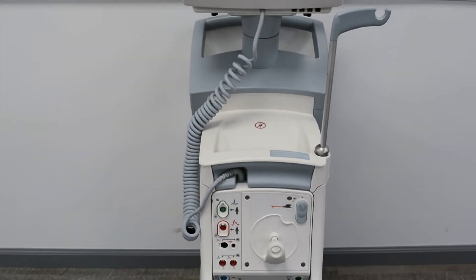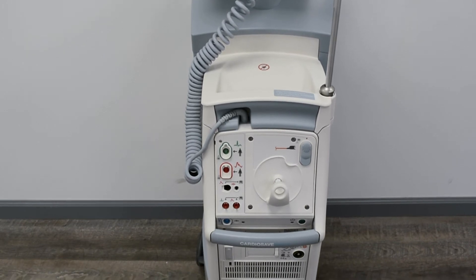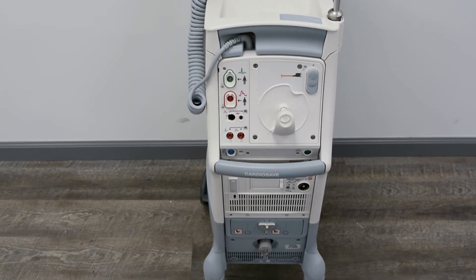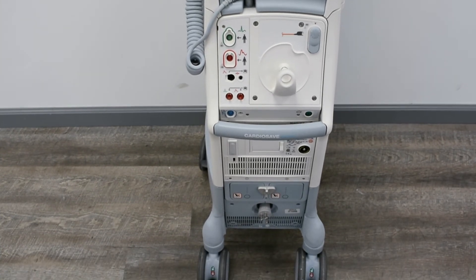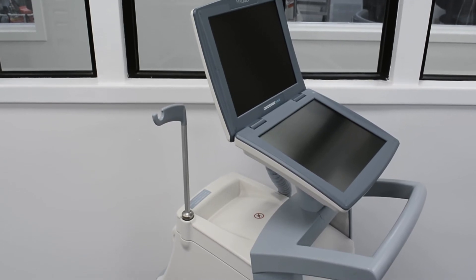The CardioSafe Hybrid is designed for use with all McKay IABs. Soma Tech International offers the refurbished McKay CardioSafe Hybrid up to 50% below the cost of new, with the same service and warranty contracts from the manufacturer.